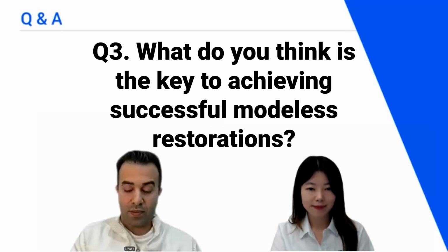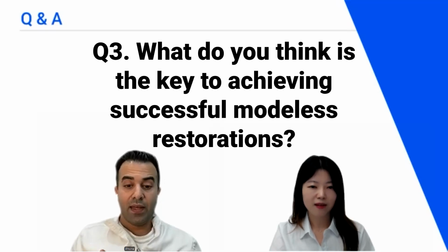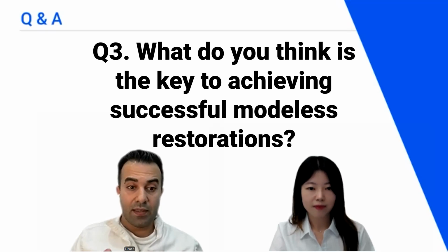Well, it is a personal preference. Myself, I haven't been doing model-less yet. However, in the future, I might change. As I said, I've been doing the hybrid workflow where I work with a model, especially working in the aesthetic zone. There are so many things we need to take into our hands and do, hand finishing and layering. And it's not only the fit. And I think model-less in the aesthetic zone is limited. Always human hand finishing and the final touches is so important.